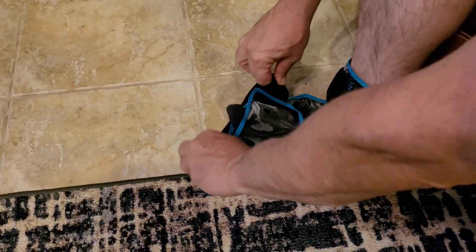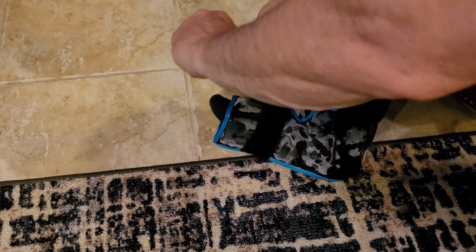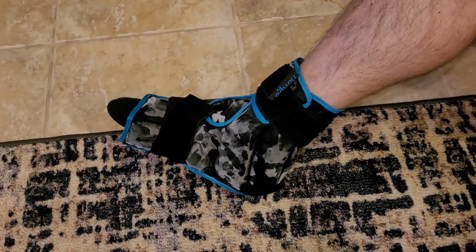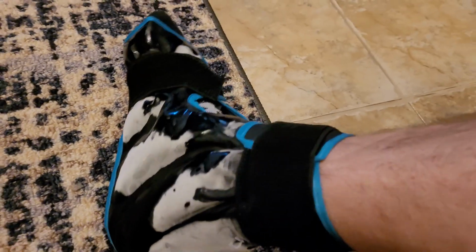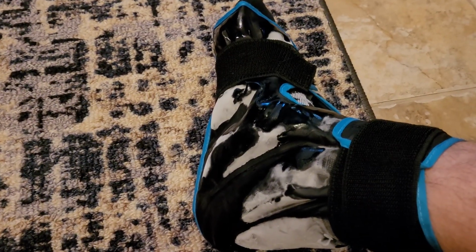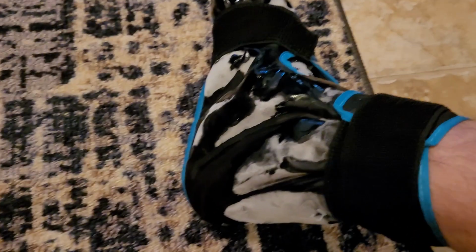I wish the straps were a little thicker or shorter, but it's the way it is. All right, leave it on there for 10 minutes. Ten minutes later, it's still really cold. Went through the pain, to the hurt, to the numb stage, which means it's time to take it off.